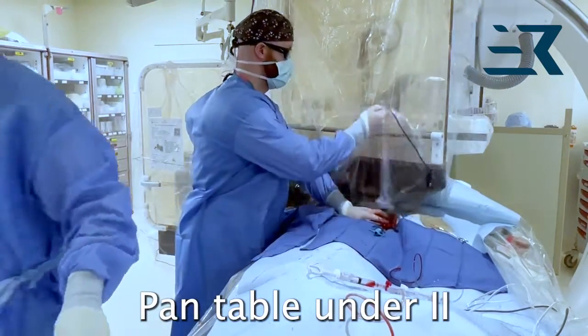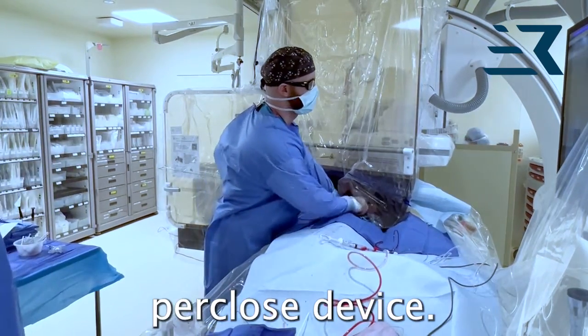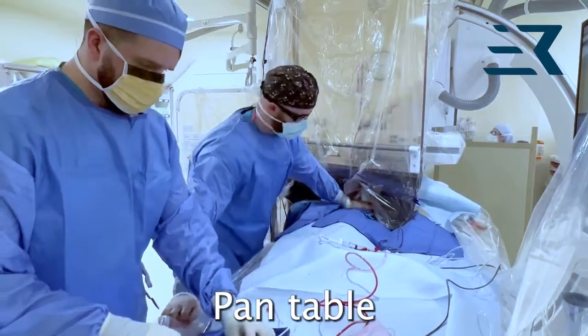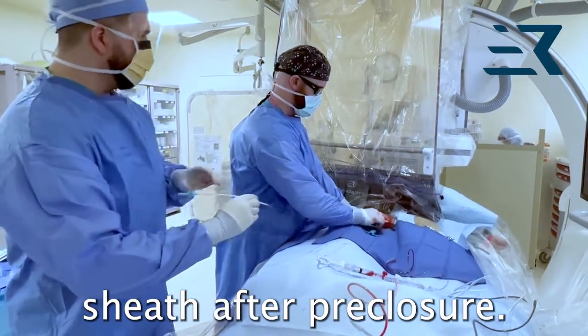Pan table under the II to follow wire insertion into the Perclose device. Pan table back out from under the II to upsize sheath after pre-closure.